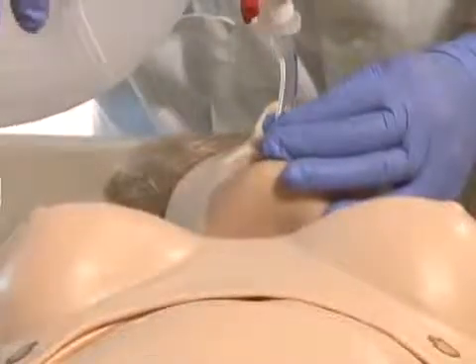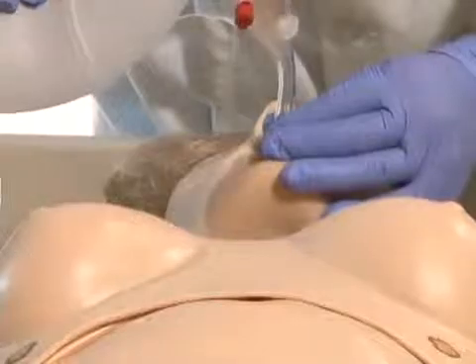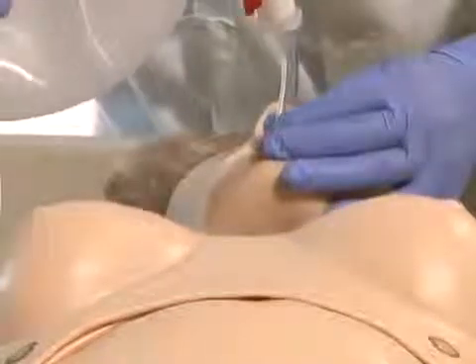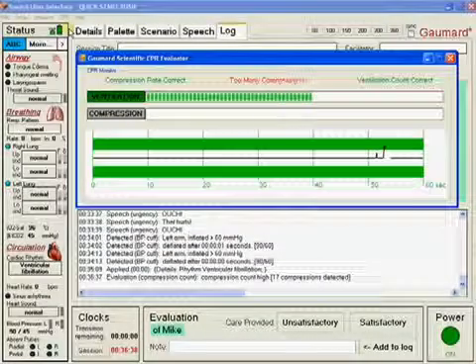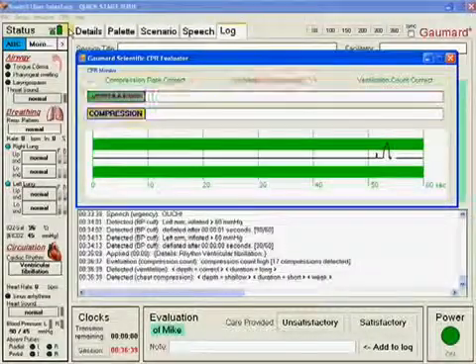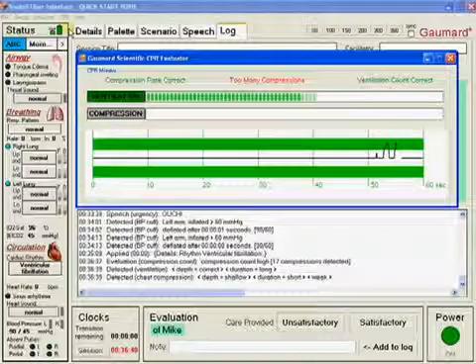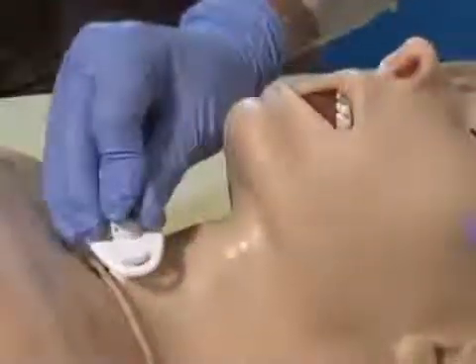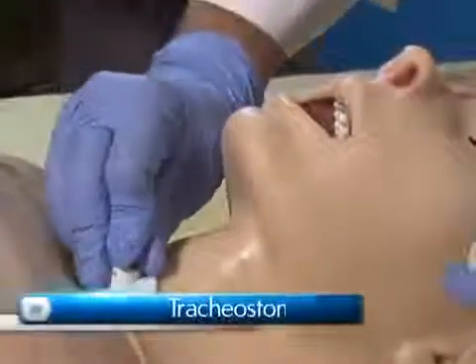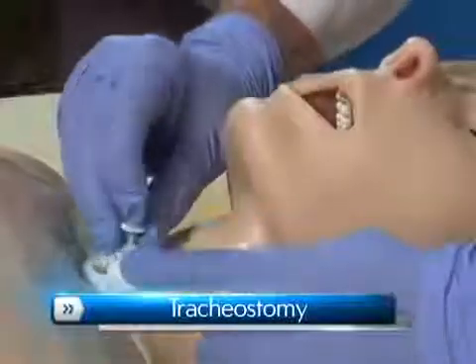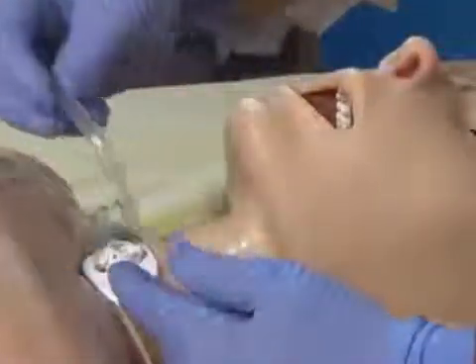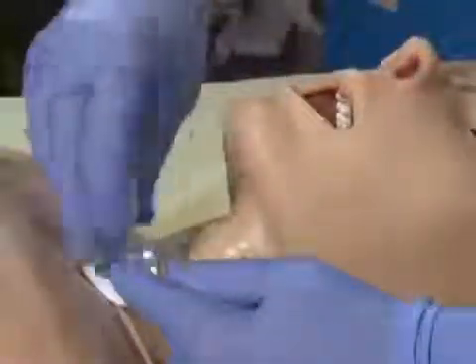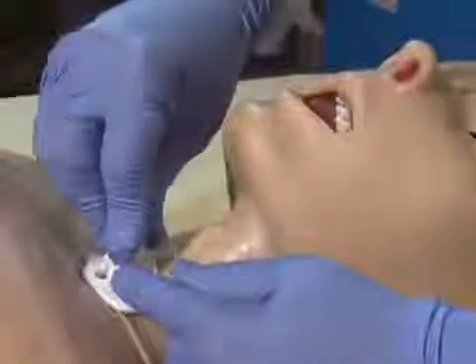Correcting the tube position enables the left lung. Ventilations are measured and logged, showing the instructor exactly how students are performing. If neither oral nor nasal intubation is possible because the airway is compromised, then a tracheostomy tube can be inserted.